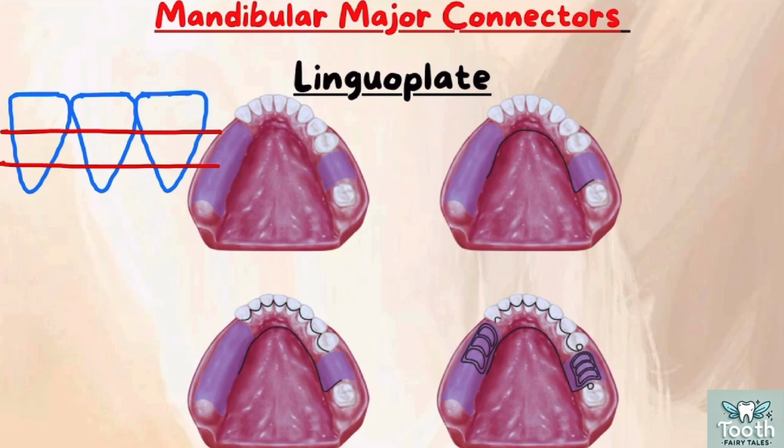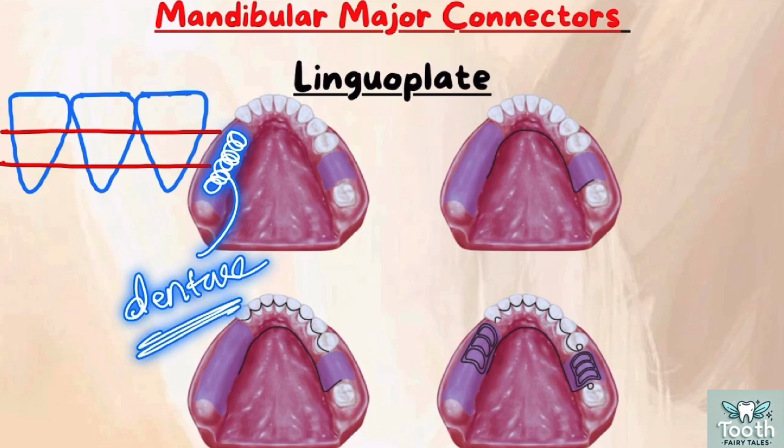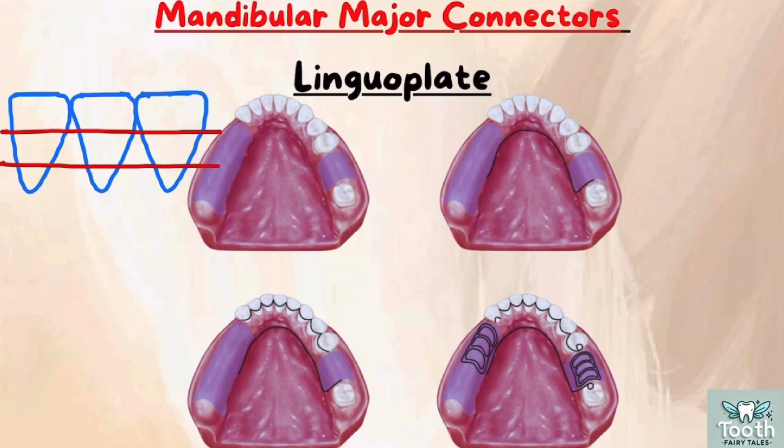What are basal seat areas? These are the portions of the gingiva which are coming in contact with the denture. So these areas are providing the stability to the denture. Next step, you have to mark the inferior border of the denture, which is marked on the diagnostic cast. After marking this, next you have to mark the superior border of the denture.